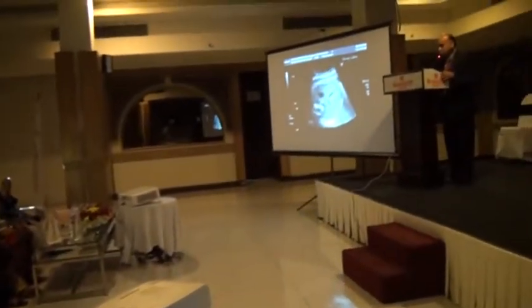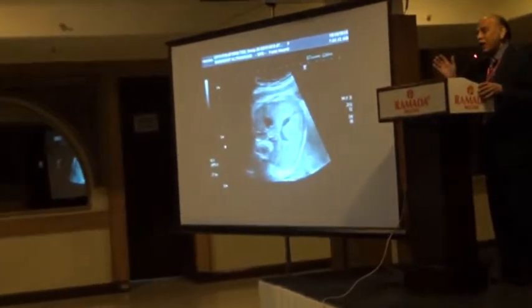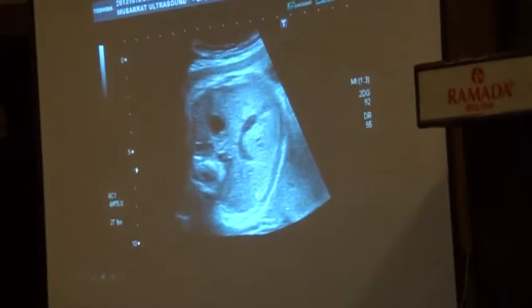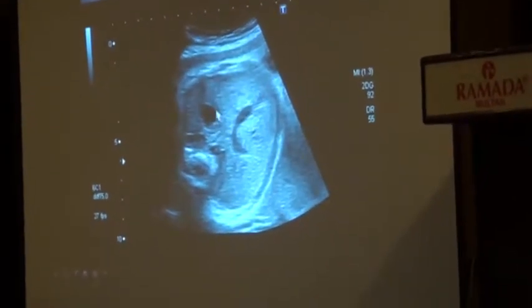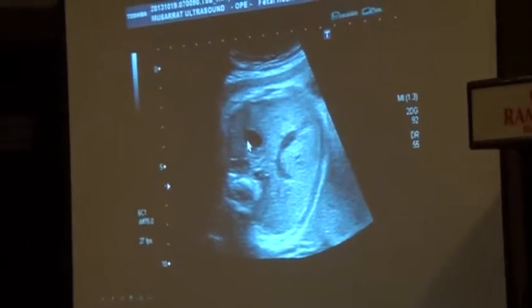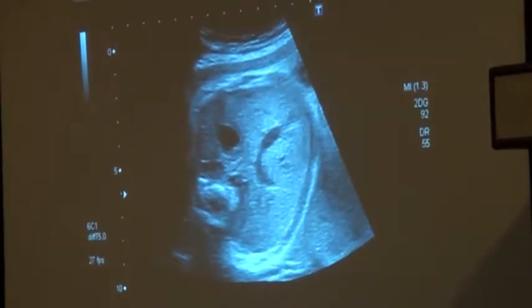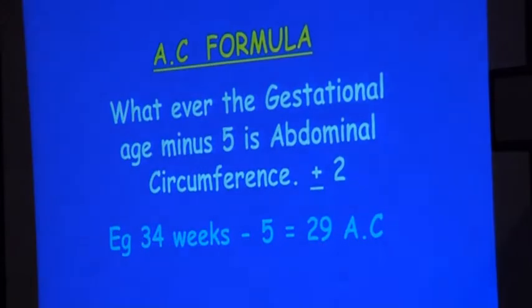So I'll remove this color, and that's a J. Beautiful J. And right behind the J is the stomach. So don't look for the stomach on this side. Where the bend of the J is, at the back of it, look for the stomach. If you find the stomach, that means no esophageal atresia or pyloric stenosis and so on and so forth.